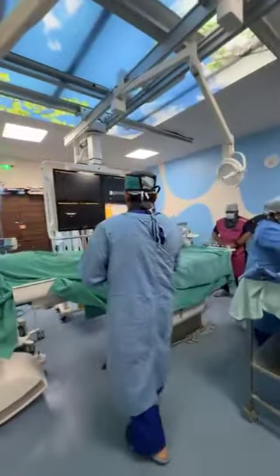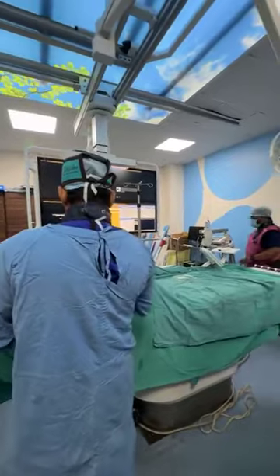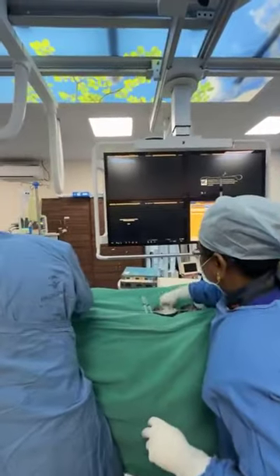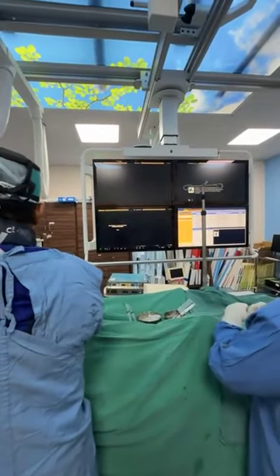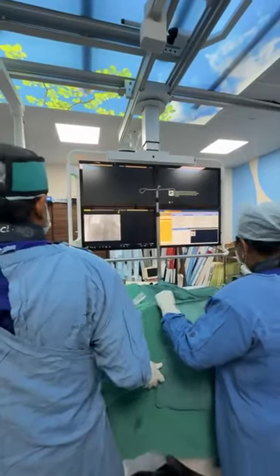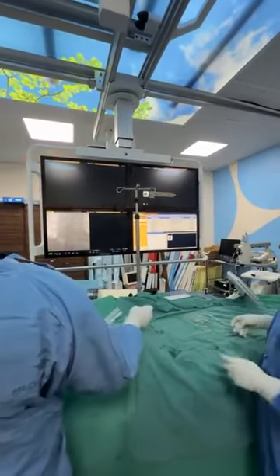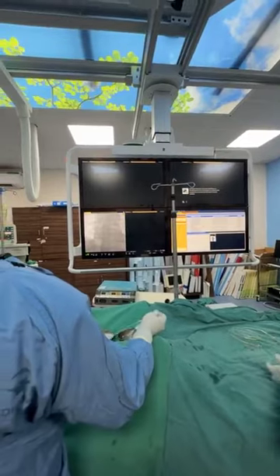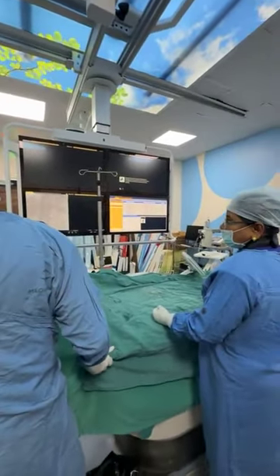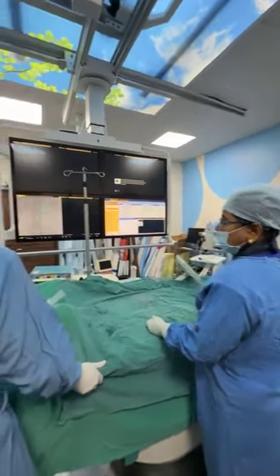The surgical bypass part has been done. Can we go with the wire here? So we have a large team of people very experienced in doing this hybrid procedure. Table, please. Slow. Table, please. So we are exactly doing what is required. Table, please. Table, please.